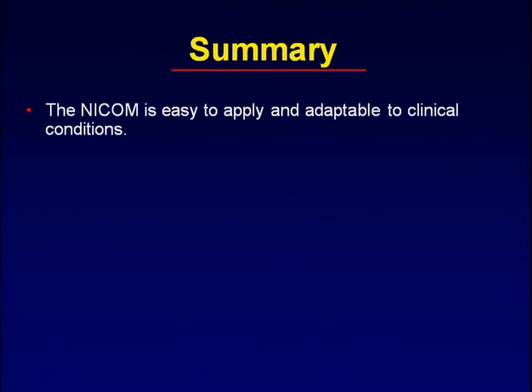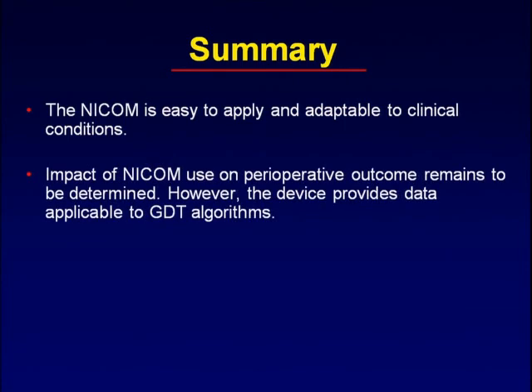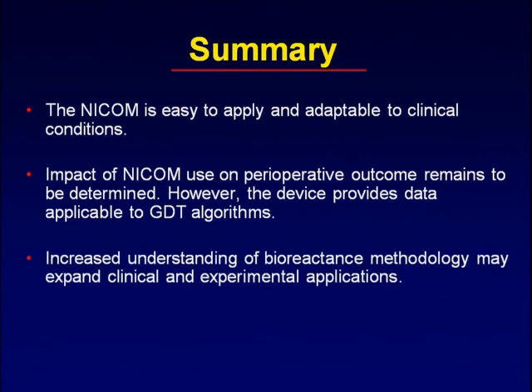So anyway, in summary, what do we have? Well, this device is easy to apply, and it's certainly adaptable to clinical conditions. The impact of the NICOM on the perioperative outcome remains to be determined, although I think work that Dr. Gann is doing is beginning to show that it does have adaptability to goal-directed algorithms and may actually prove particularly useful in those scenarios.